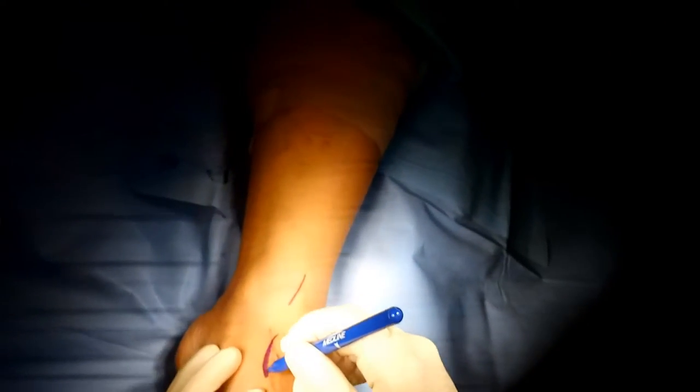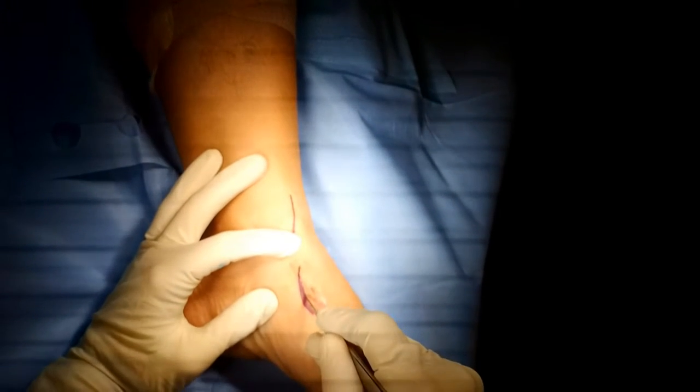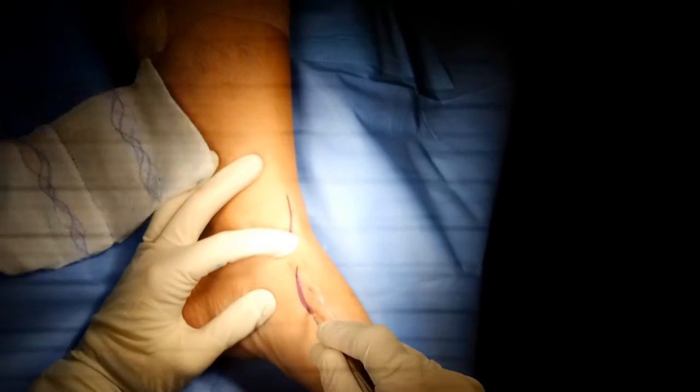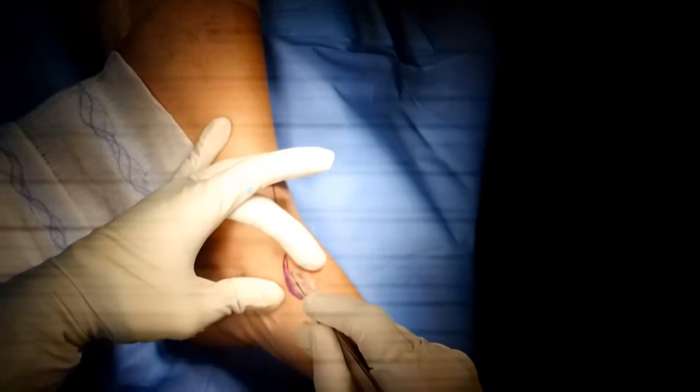Hi, this is Dr. Gennady Kolodenkir. I'll be going over how to fix the anterior tibial tendon rupture utilizing a minimally invasive type of technique. Incision placement is going to be over the insertion of the anterior tibial tendon around the midfoot and proximally at the ankle.